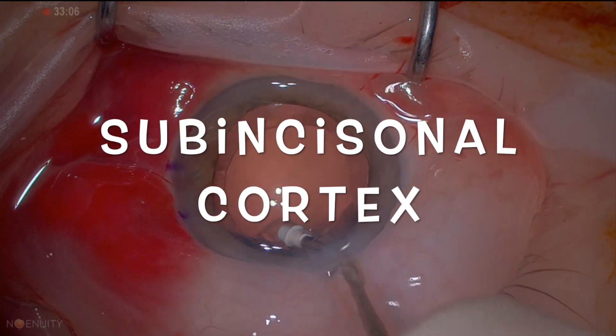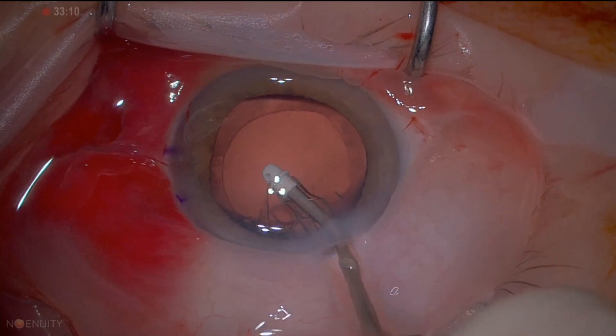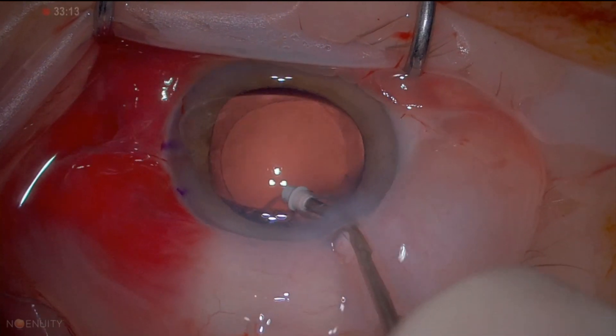Hi, it's Ahmed Salam here. In this video I'd like to focus on the problem with sub-incisional cortical lens matter removal using coaxial IA.